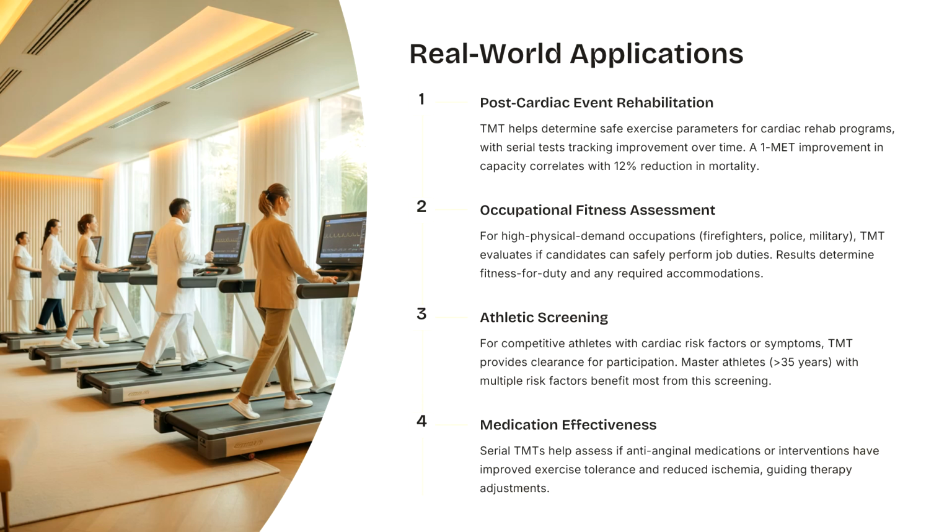Next, occupational fitness assessment. In the case of firefighters, police, and the military, where physical strength is required, this TMT test is very important for the selection of the proper candidates. Athletic screening. Master athletes more than 35 years old with multiple risk factors should be screened before sending them for vital competitive sports.